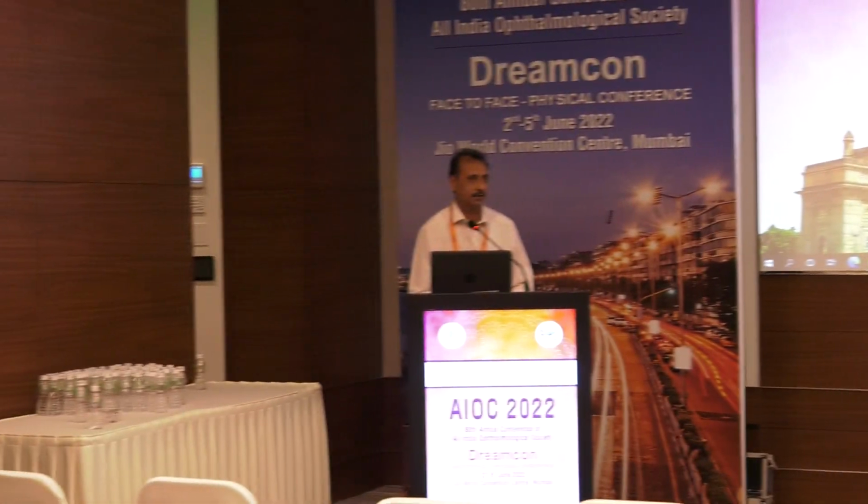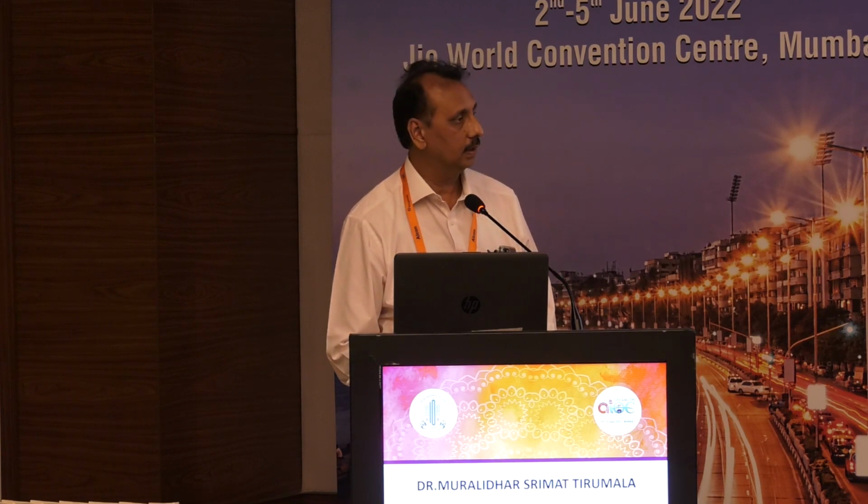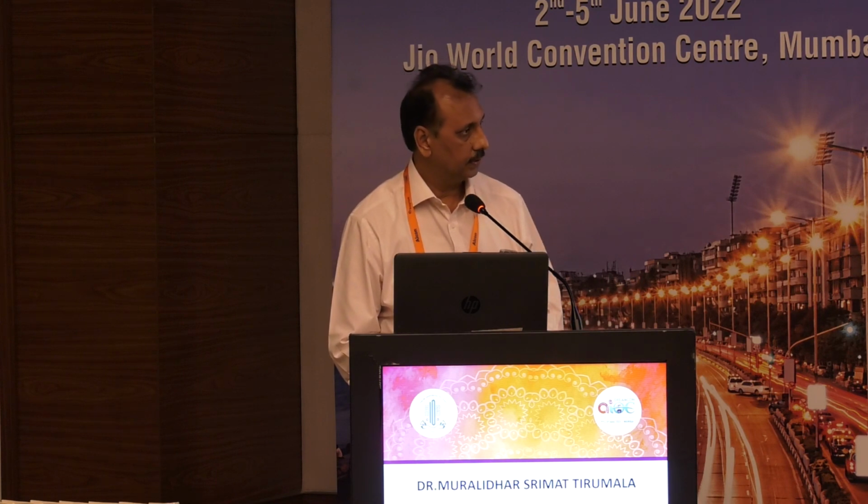I purposely did not involve autofluorescence much in this because I was not knowing who the audience was. But in the interest of the audience, I normally use 2 wavelengths in autofluorescence regularly. One is the blue peak autofluorescence, which is more for the lipofuscin material. But interestingly, if you use the near infrared autofluorescence, you have the melanin component, which shows you the abnormalities.